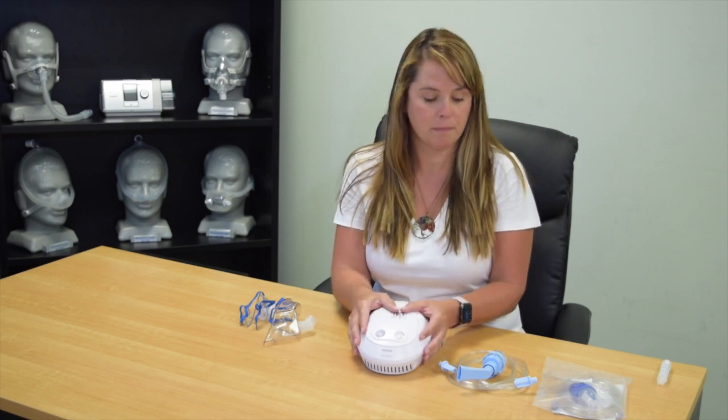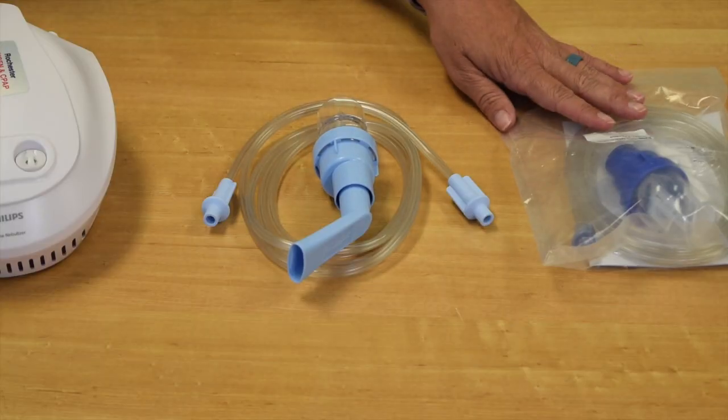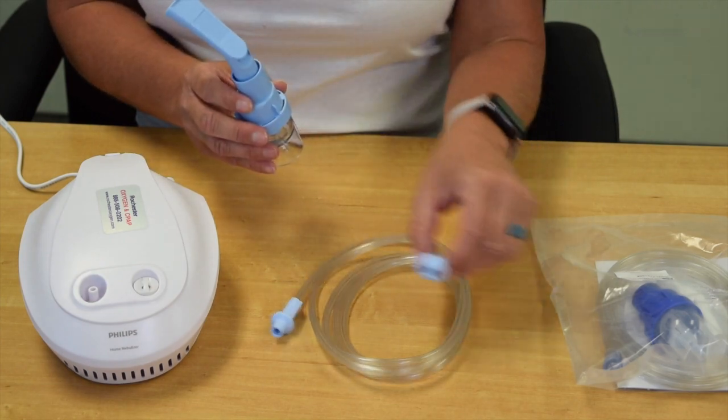So when you receive your box, you're going to want to remove everything. Here I have my compressor and I have two nebulizer kits. So my first kit is my reusable one, which I'm going to use, and this kit is good for about 6 months. We have our disposable kit that we would use in case of anything happening to our reusable one. So I'm going to go ahead and get my kit hooked up to my compressor.